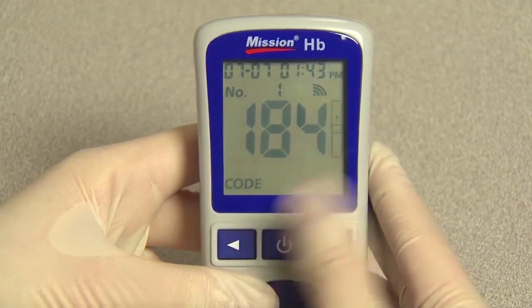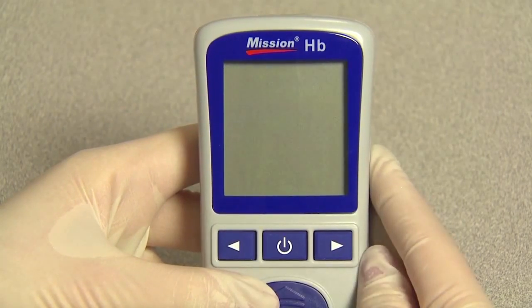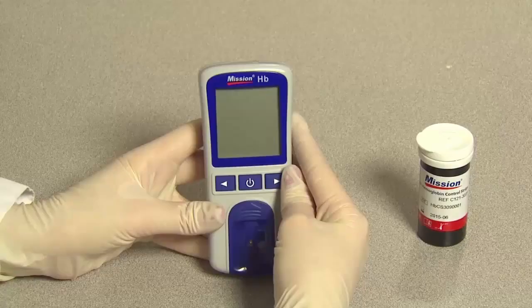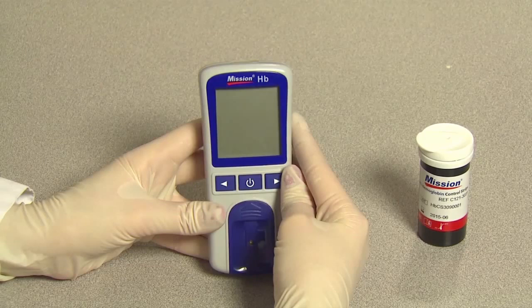Press the power button to turn off the meter. Performing an optical system check. The optical system check is performed to ensure that the meter's optical system is functioning properly.